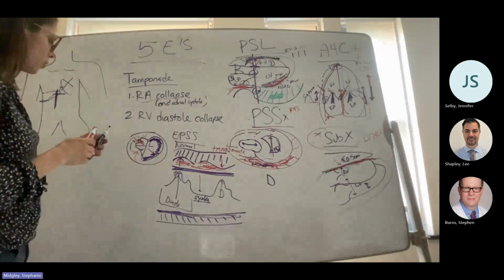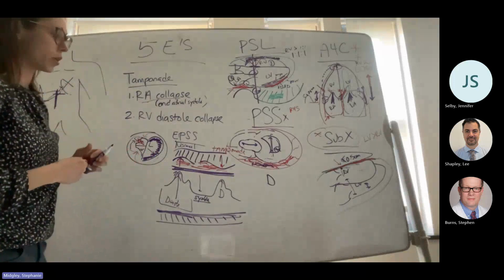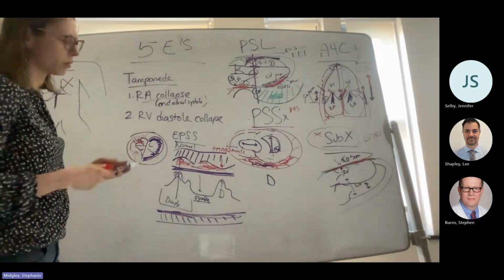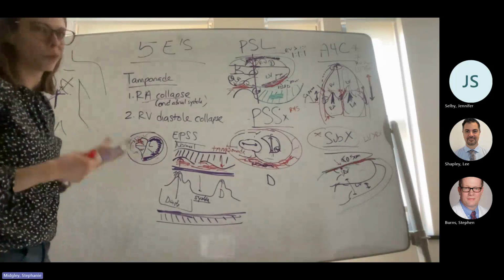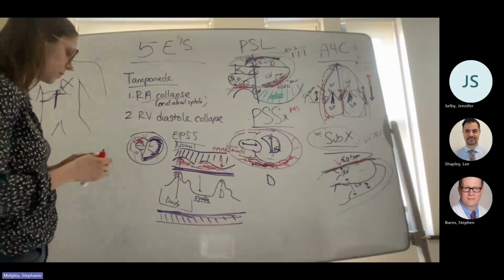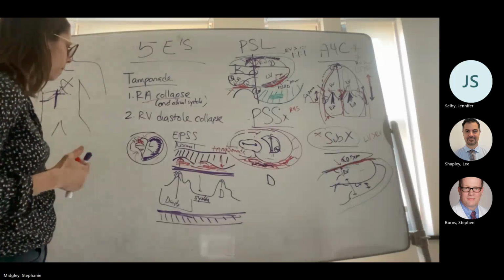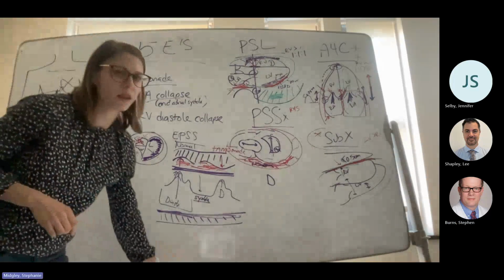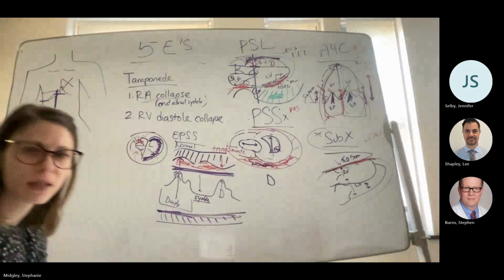So don't feel like a failure if you do an echo and you're like, there's tamponade, and then cardiology does it after they're resuscitated and it's not there anymore. That's normal. That's the way the physiology works. You fixed them. Okay. I think that's the basics.